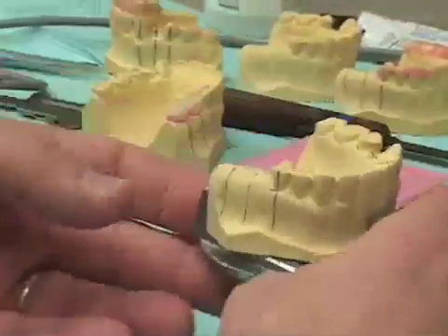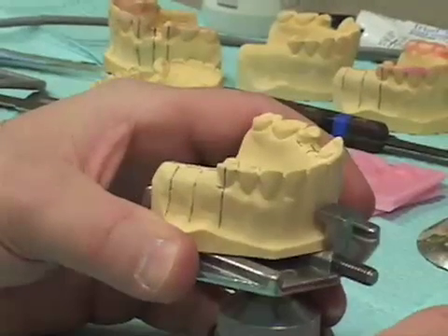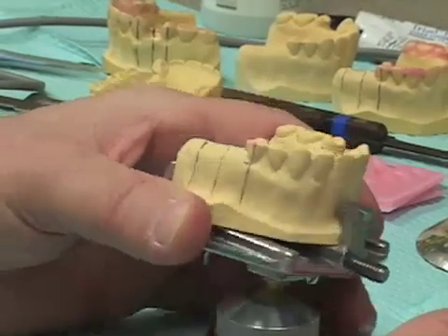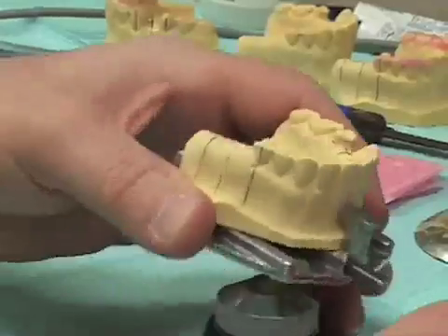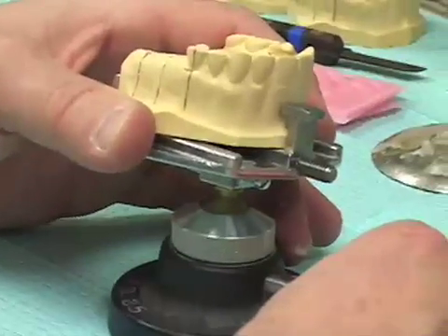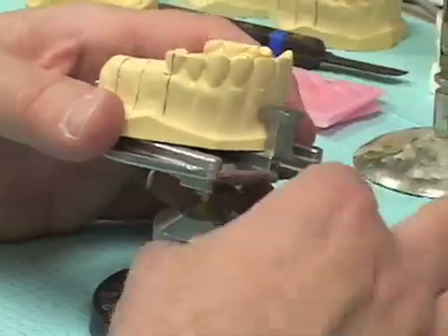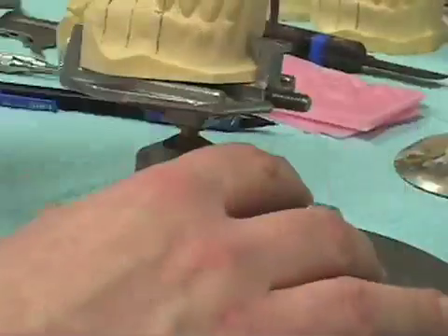Here we have our dental surveyor table. By loosening the knurled nut at the front of it, this can be oriented in many different ways. We basically estimate an orientation, tighten the surveyor table, and then bring in our dental surveyor.